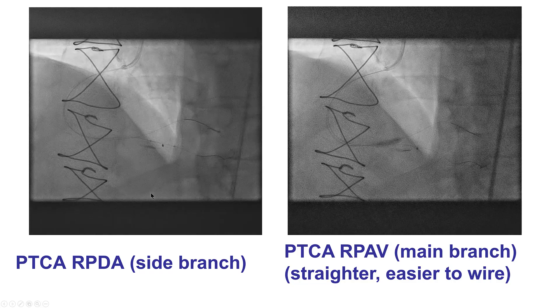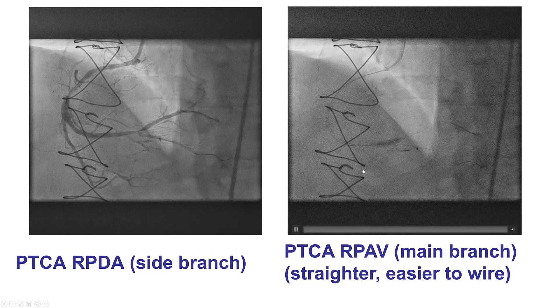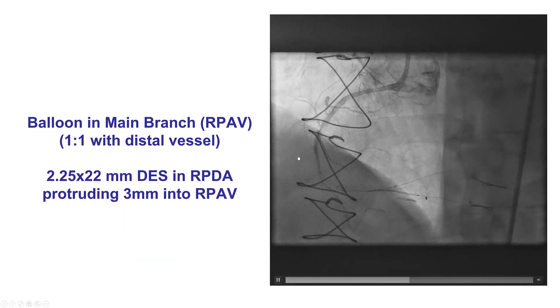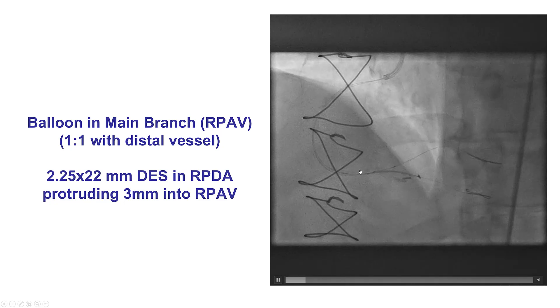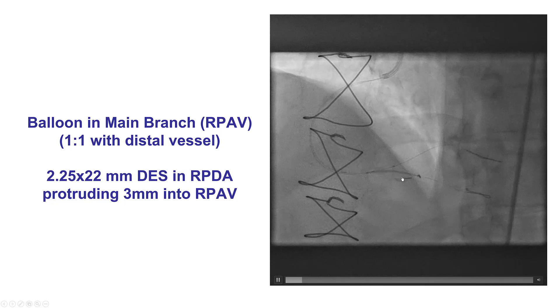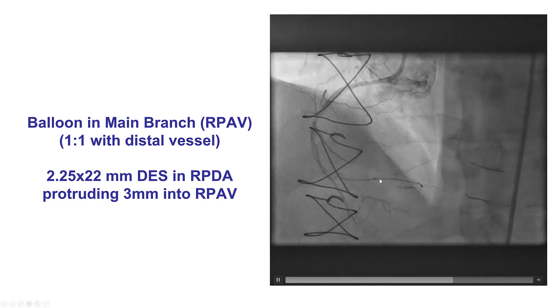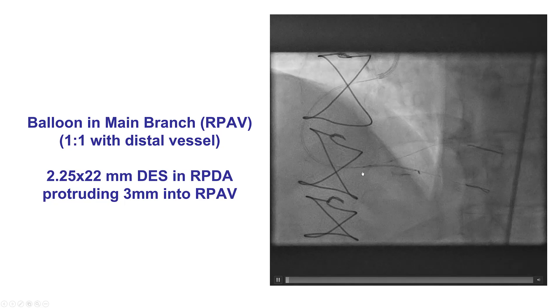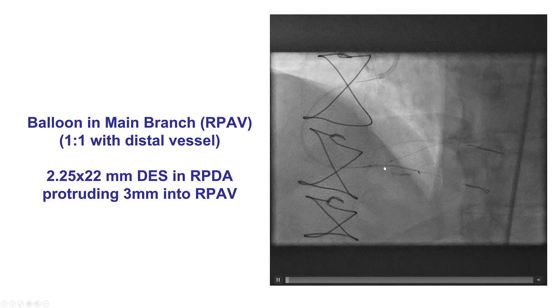We wired both vessels, then pre-dilated both vessels, and were ready to start with stenting. We had to decide which would be the main vessel and which would be the side branch. Because of the difficulties we had wiring the PDA, we decided to stent the PDA first, which would straighten the vessel and make subsequent rewiring attempts easier. We placed a 2.25 by 22 mm drug-eluting stent in the PDA, slightly protruding back into the distal right coronary artery.